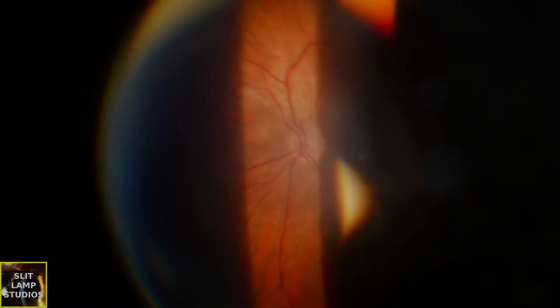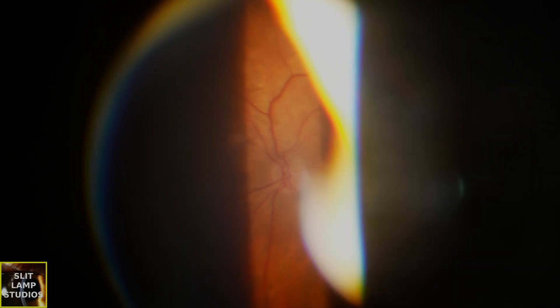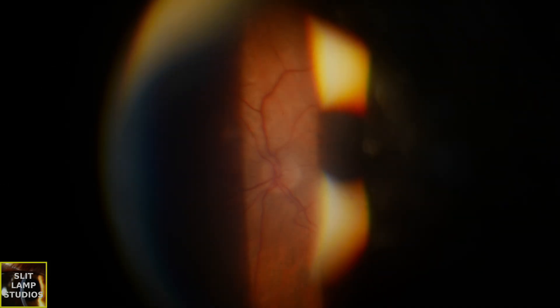So let's see what's going on here. Is that a Weiss ring I can see? If I pull back slightly and focus there — can you guys see that Weiss ring? Yes, the answer is this patient has a PVD. Hope you agree with me.